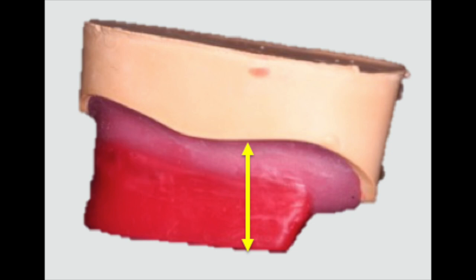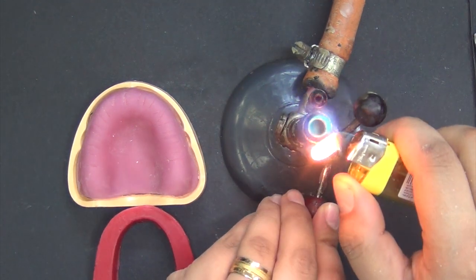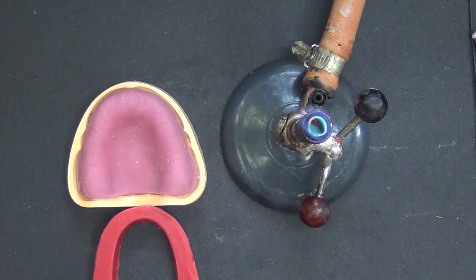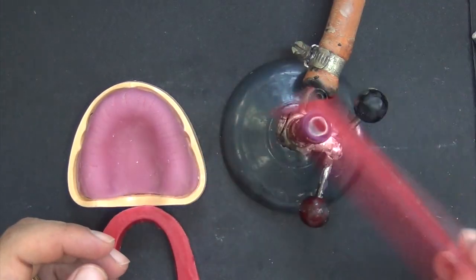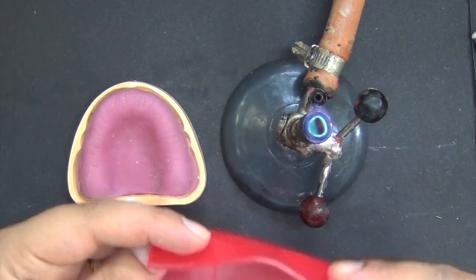The posterior height of the rim is 18 mm from the deepest point on the buccal flange to the occlusal plane. The posterior width of the rim is 10 mm. You will receive a ready-made occlusion rim, which you'll be required to adapt to the temporary denture base you made earlier. Soften an extra sheet of base plate wax to seal the occlusion rim to the record base.